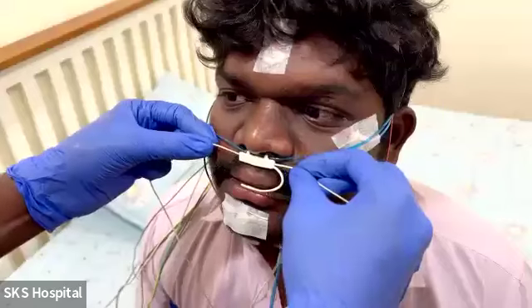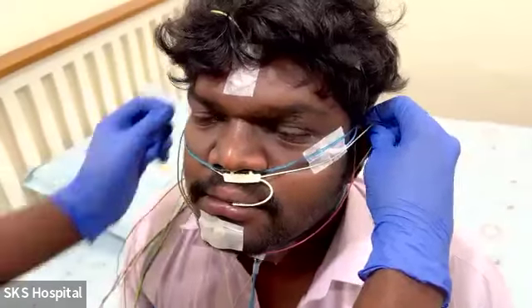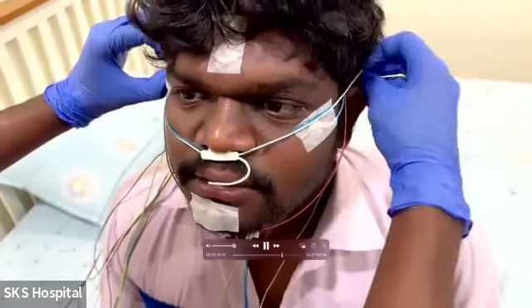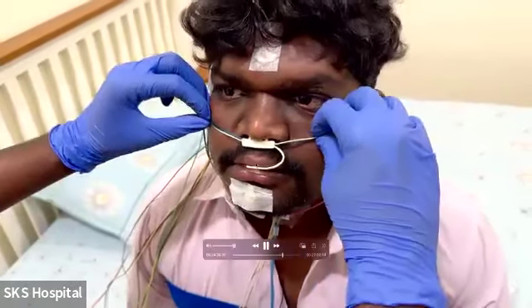This is the thermistor, which is connected just like a nasal cannula. And the small loop that is coming below is to pick up oral breathing or mouth breathing when the patient opens his mouth. The nasal sensors may not pick it up, so the oral sensor might pick it up, just to tell us whether the patient is breathing or not, whether there is apnea or a hypopnea or not.